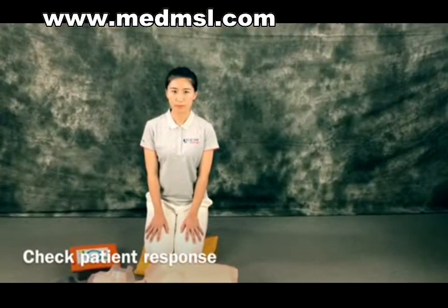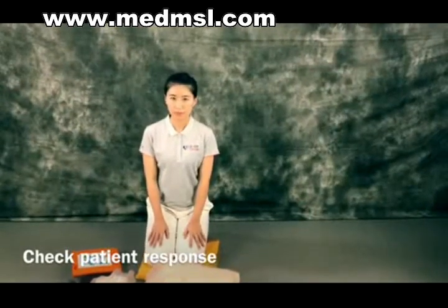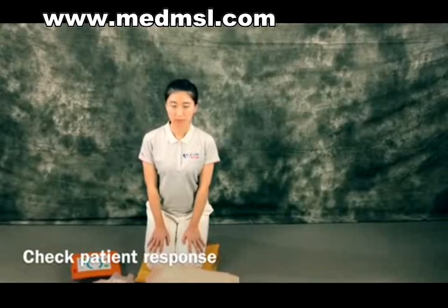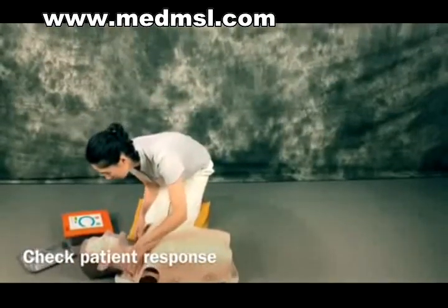How to use an AED. Make sure you, the victim, and any bystanders are safe. Check the victim for response. Gently shake his shoulders and ask loudly, "Are you alright?"